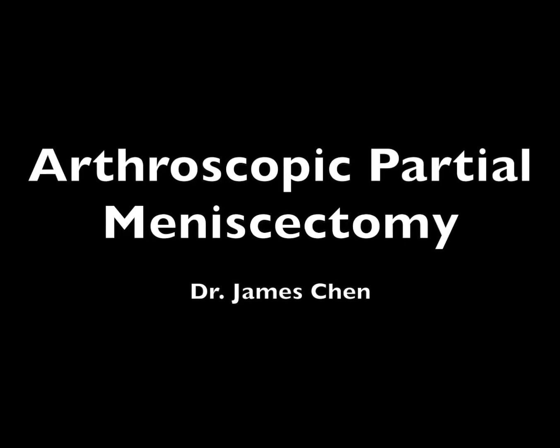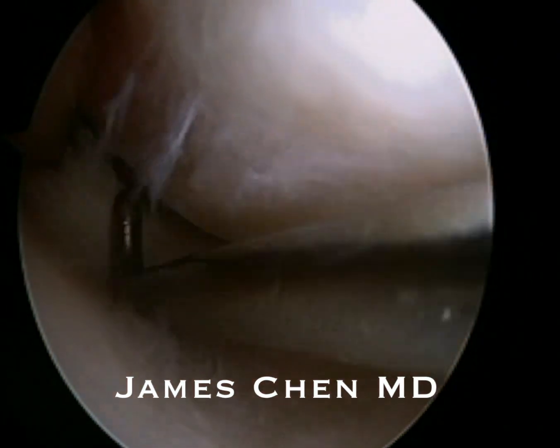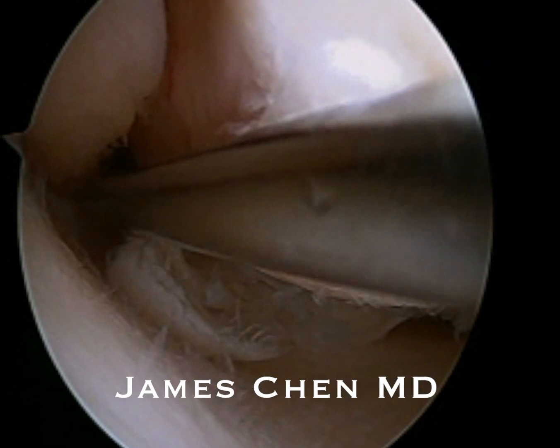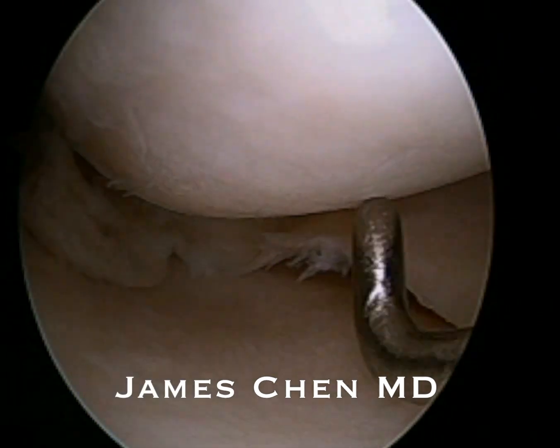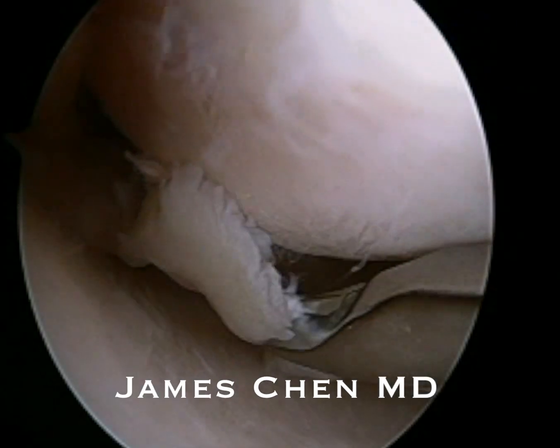This is a video of an arthroscopic partial medial meniscectomy. I am looking in the medial compartment of the joint, probing an undersurface cleavage tear that has a flap component. We call this a parrot beak type of flap that flips in the joint.